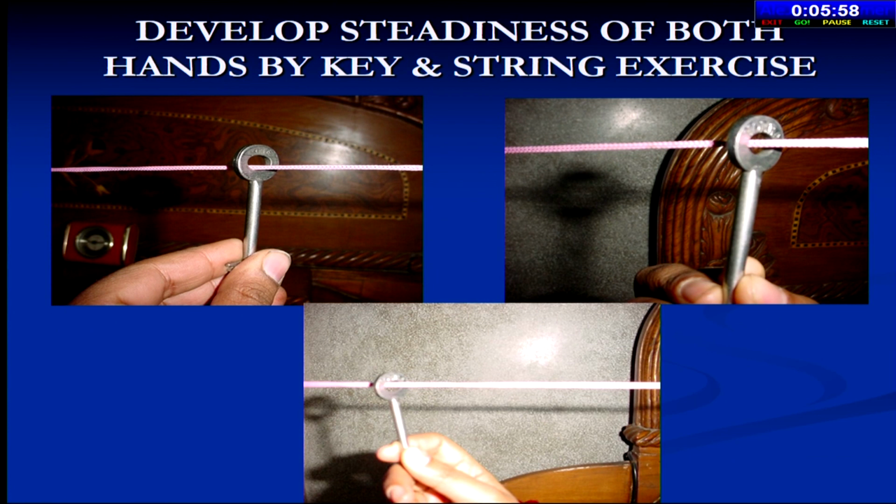Learn these things. You need both hands for Phaco surgery. Steady hands, both, are a must. This simple technique you will see in a village mela: you put one wire, put one key, and current flows and makes a sound once it touches. You have a wire and a battery which tells you if you touch it, it will make a sound.